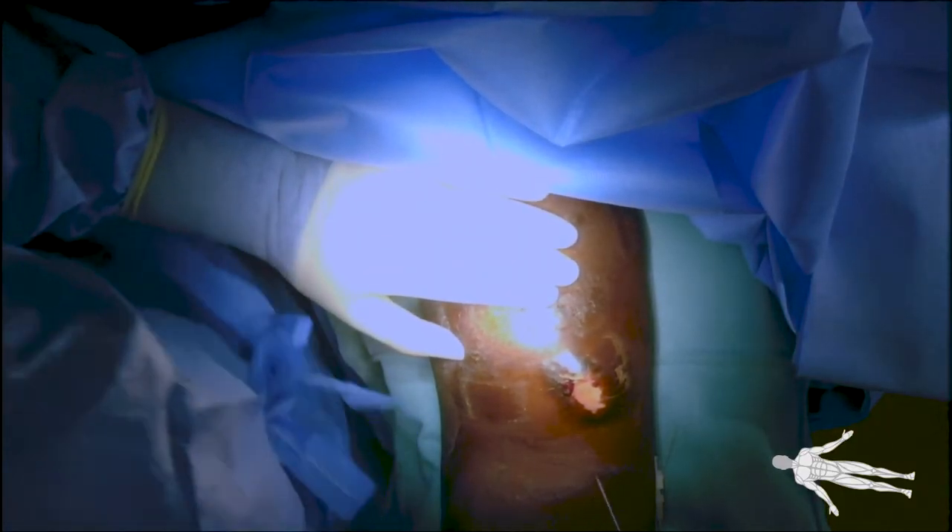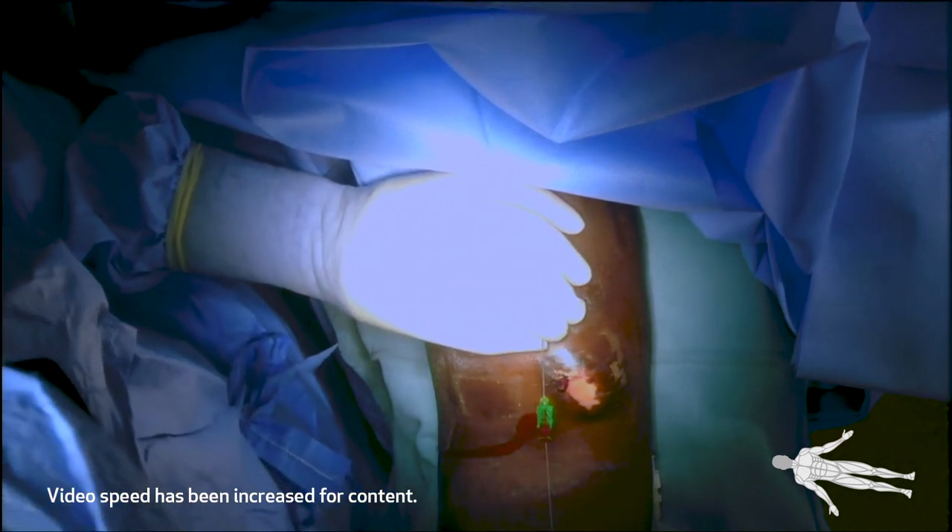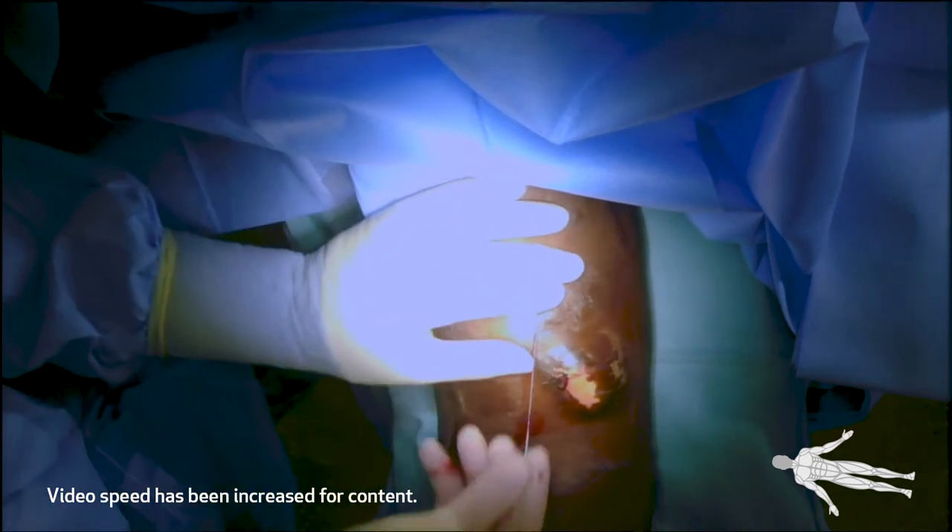Ultrasound imaging was used to identify a patent fistula. The fistula was accessed using a micropuncture needle and wire, followed by a micropuncture sheath.